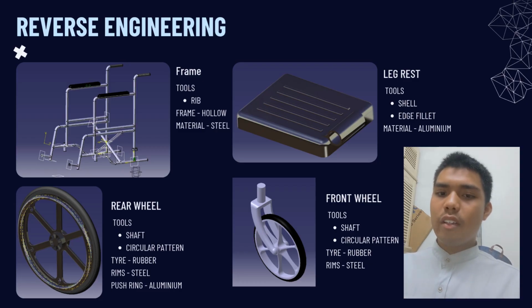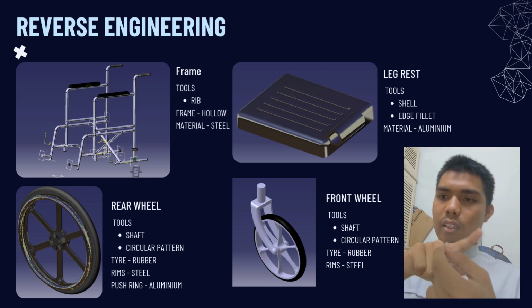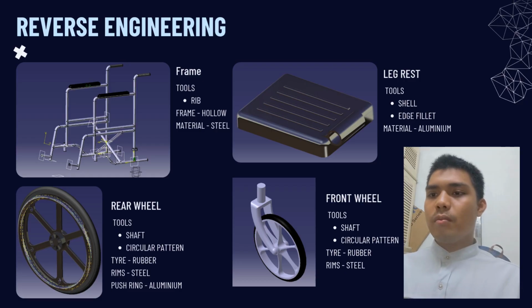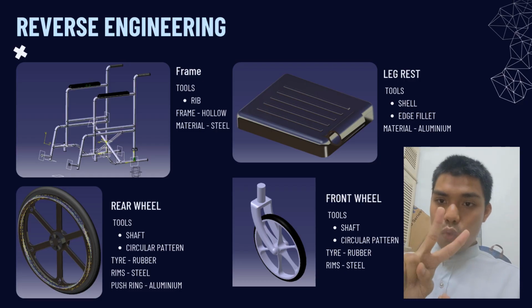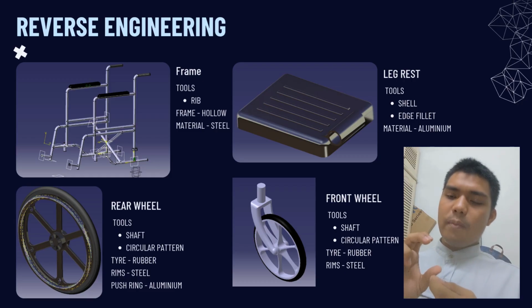The material for the leg rest is aluminium. And the last one, we use front wheel. The front wheel, which is the same as a real race wheelchair, we use a shaft to make a circular rubber tire and circular metal for the rims. You can see that they have two materials: the tire is rubber, and the rims use steel.